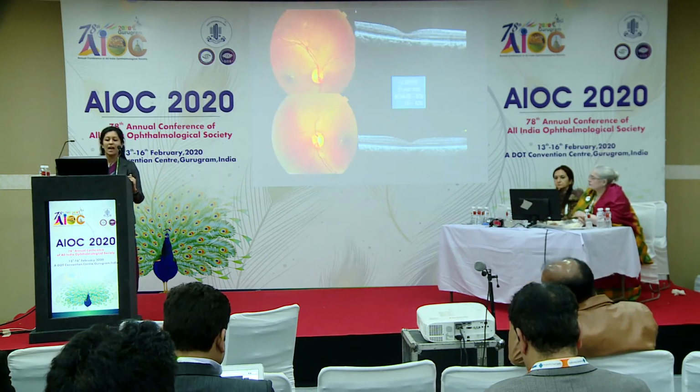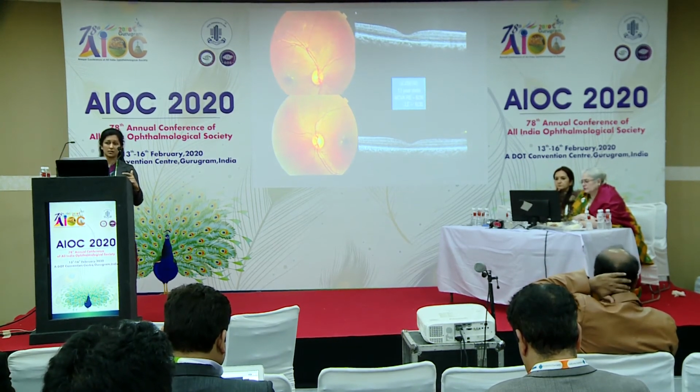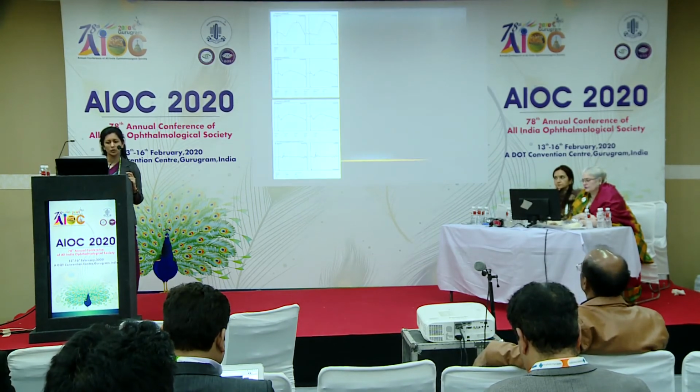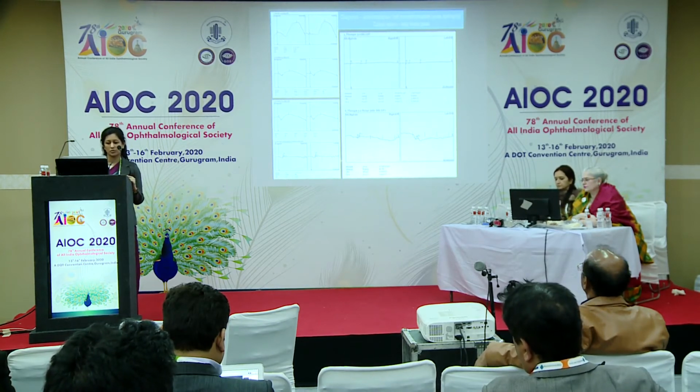Whenever we see a macular lesion, we suspect a dystrophy, and this term we commonly use. So this is a young male who had decreased vision and difficult to take the fundus picture, so that's a pointer. Some EZ defects on OCT. We already know the diagnosis, but ERG will help us to confirm that it is a case of achromatopsia, and of course the color vision is affected.